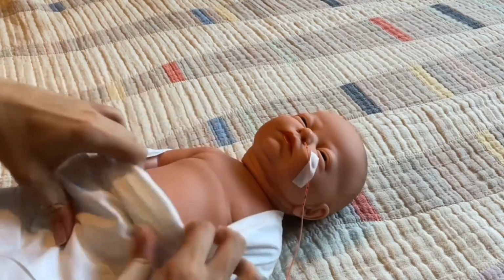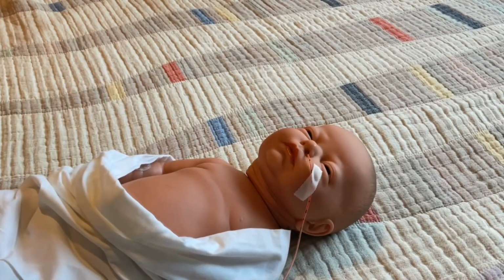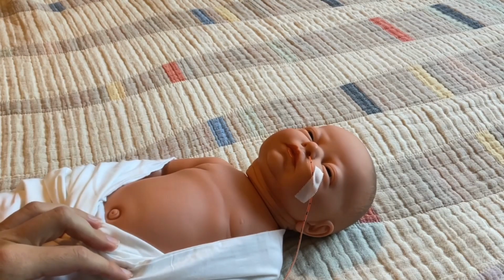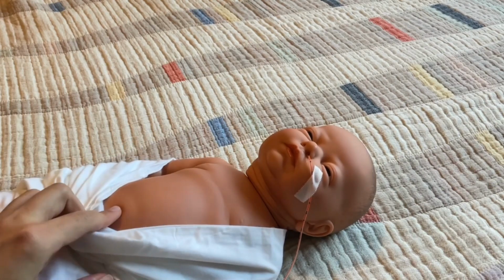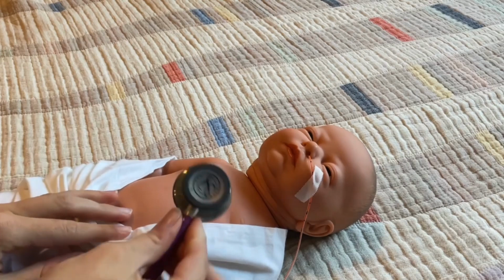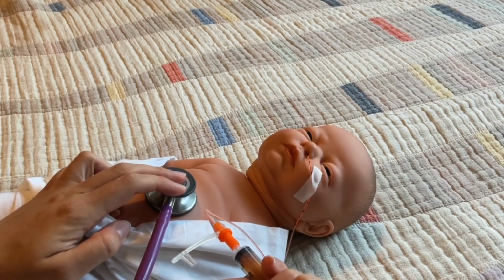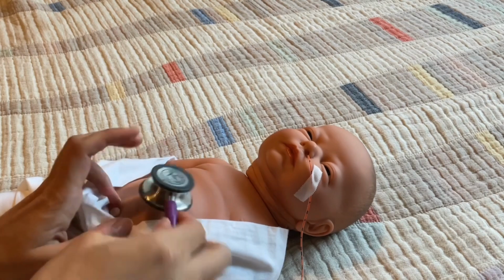You can unwrap baby so that you can listen for your whoosh sound. Take your stethoscope and put your stethoscope in the epigastric region. That is the same point in between the breastbone and the belly button. Push your air and you should hear a whoosh sound. If you hear the whoosh sound, you know you're in the correct spot.